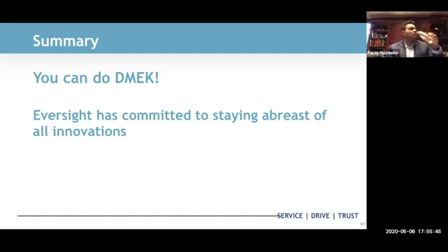Next question, do your patients feel much discomfort when you do the iridectomy if you're only using topical anesthesia for your DMECs? Yeah, maybe a little. I can't speak from being on that side of the table, but most patients don't feel significant discomfort. I do it with a vitrector, so it's really not even 1 second, I'd say half a second of discomfort. So they might feel a little pinch, but it's not unbearable, as you would think.